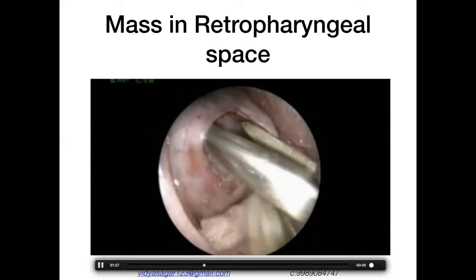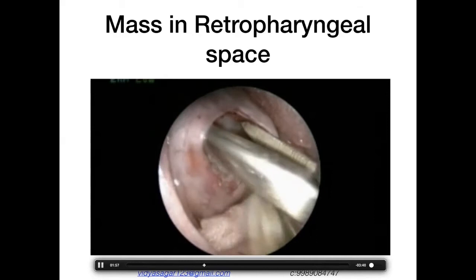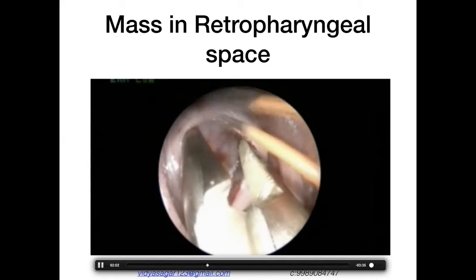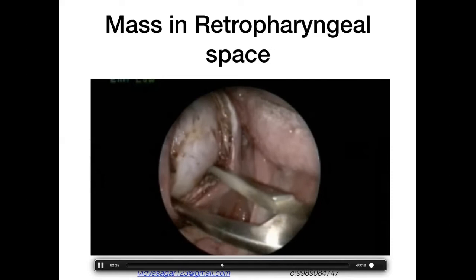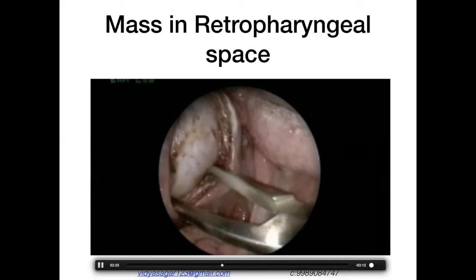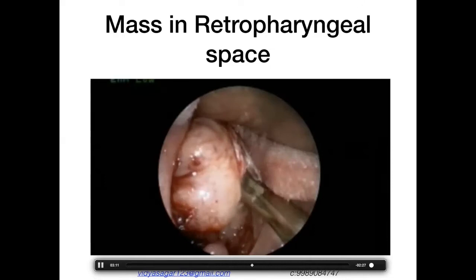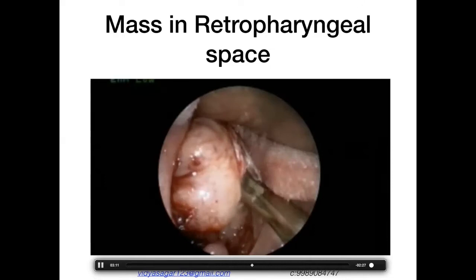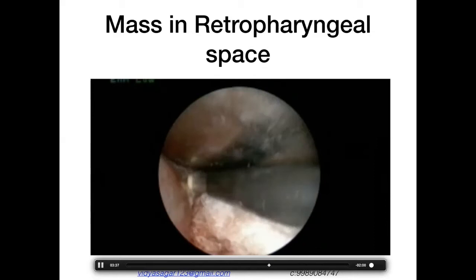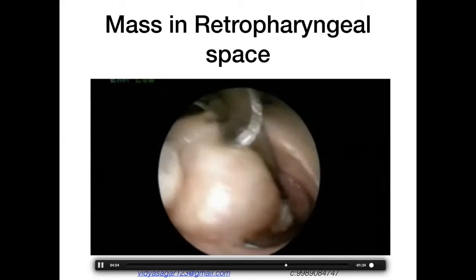For big vessels we used bipolar; for surface capillaries over the lesion we used the coblator — alternating the two. We achieved good hemostasis. With finger dissection we elevated the lesion from the lateral pharyngeal wall and excised it in toto. An endoscope was inserted to examine the bed.